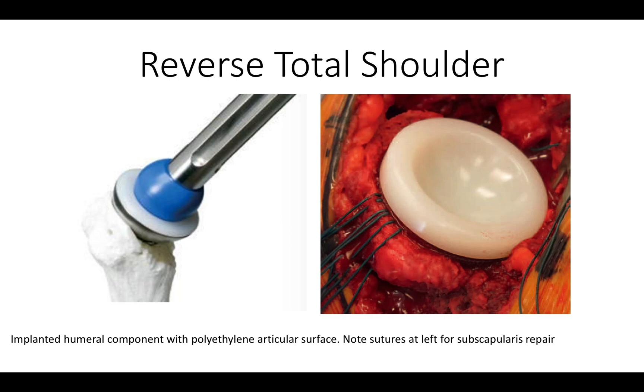Once the humerus is prepared, we impact the assembled humeral component with its cup and polyethylene liner into the prepared humerus. Here you can see the sutures that we'll use for repairing the subscapularis. We always prefer to repair the subscapularis because it adds strength and stability to the shoulder.